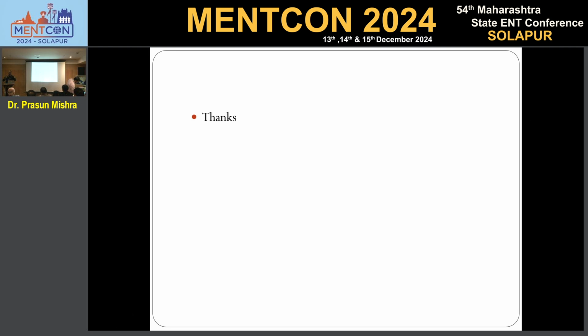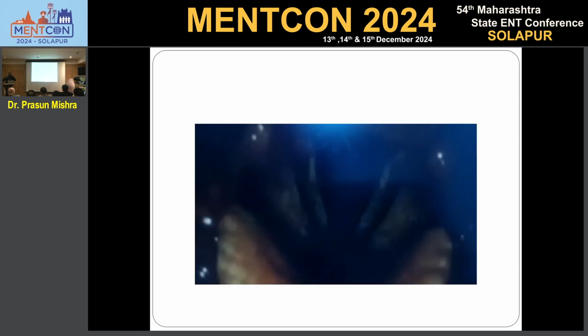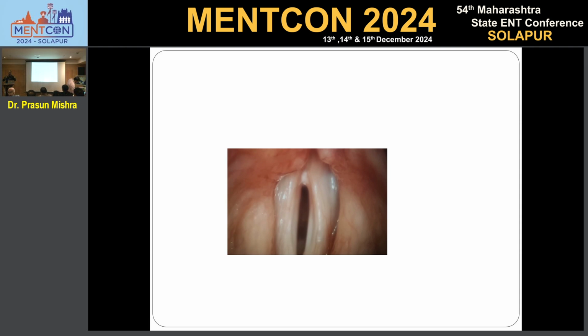If you have any video of stroboscopy, I can show in a live patient here what to analyze. Yeah, we can do that. Anybody, please volunteer. Or I just have a normal strobe video.